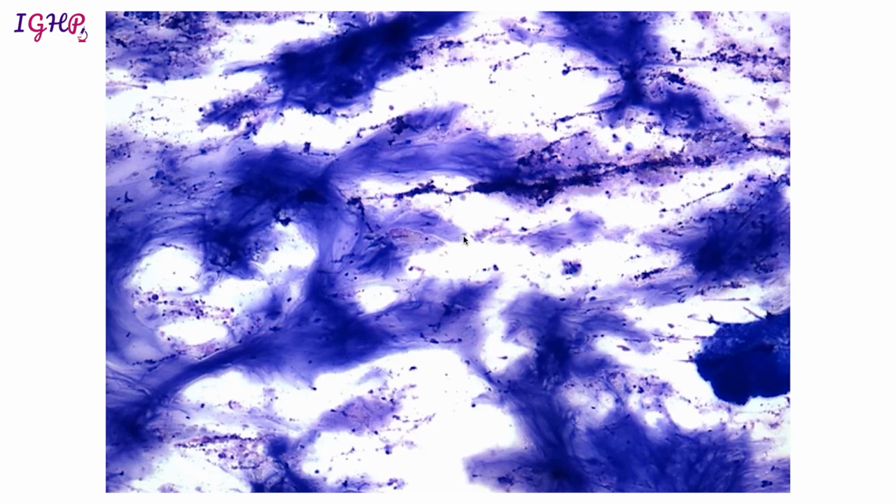If we are finding papilloid clusters within the mucin flakes, then we will think of IPMN, whereas if we are finding scanty tall columnar epithelial cells and predominantly mucinous material, then we are going to think of a mucinous neoplasm. Again, we are going to take the help of CEA and amylase level if known, and if they are not known, we will just say that this is a cystic mucinous neoplasm in which occasional benign columnar epithelial cells are evident.